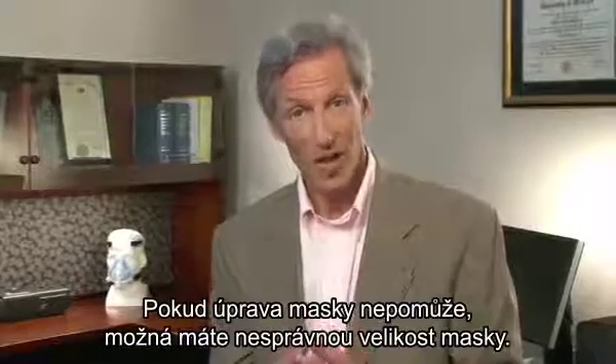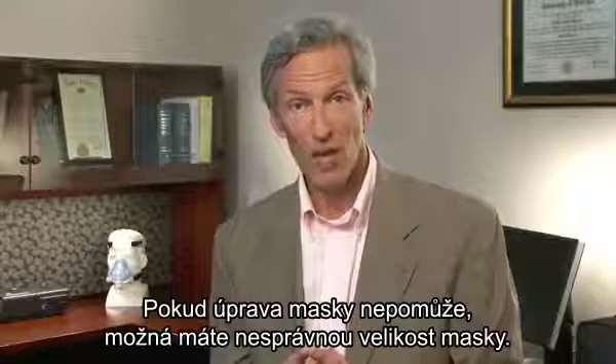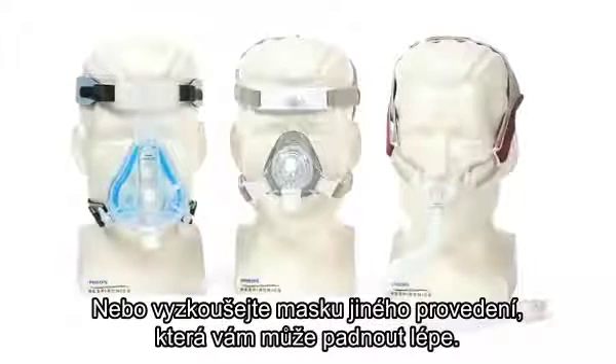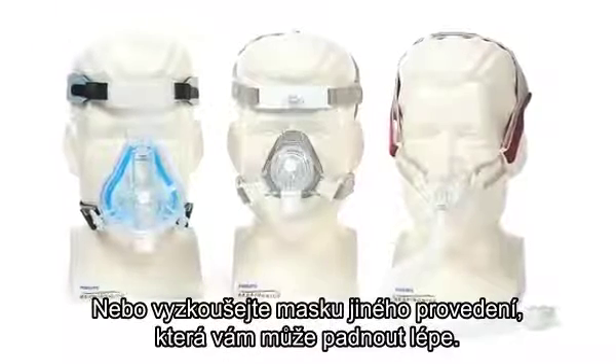If adjusting your mask does not help, then you may have the wrong mask size. Consult your home care provider for a mask fitting or to try a different style mask, which may provide a better fit.